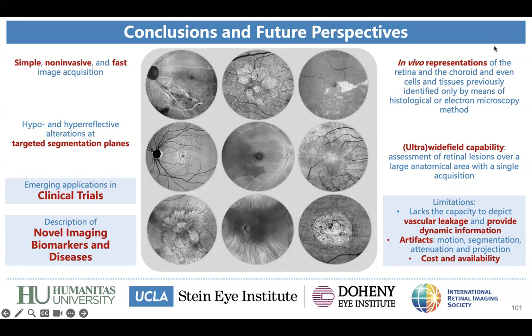And my question for you is, do you think that en face imaging will be better or will get more information from this kind of new technology? Or do you think that the spatial resolution is the main point of en face imaging?